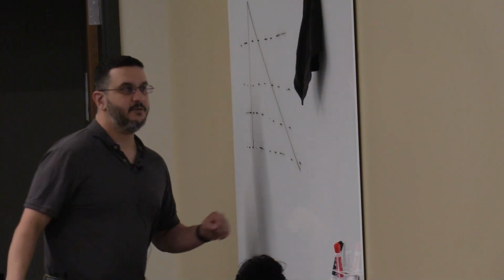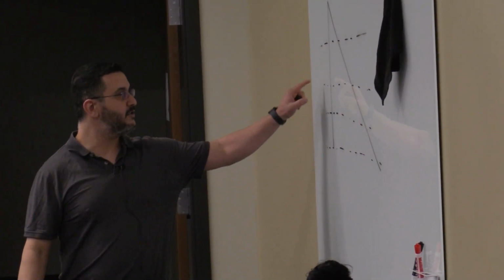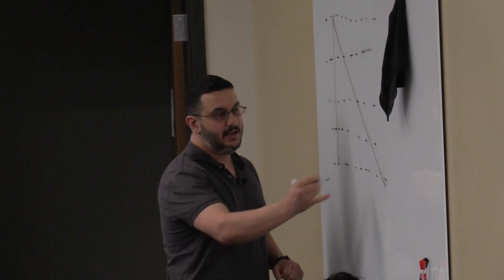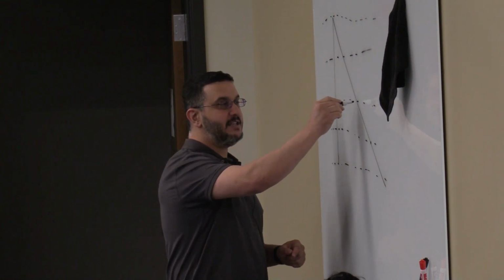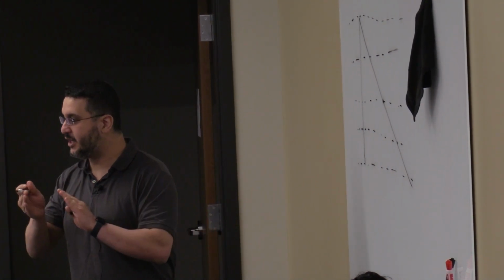You guys see that? Everyone can see that? Okay. This is 0, 1, 2, 3, 4. If you have me set to 25, it will cut the breath off once I get to here, 25 liters a minute, or whatever, like a quarter. If you have it set to 50%, it will cut me off here, and it will make my breath shorter. It will decrease my tidal volume.